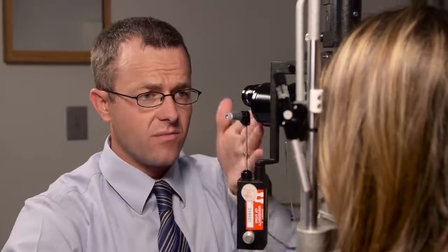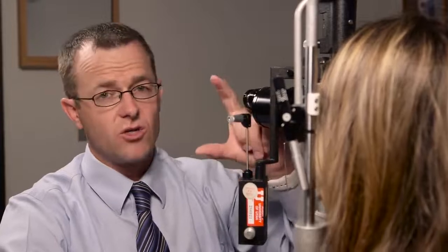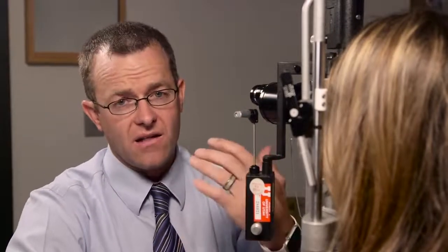First and foremost, I like to do my posterior segment exam using this 78 diopter lens, and I like to do it with my beam not shifted to one side or slanted to one side or the other, but straight on. I feel like that helps me to focus it. Also, what I do is I make my beam a little bit taller and I make it a little bit narrower. And then once I have the nerve and the blood vessels and the macula in focus, then I'll change the size a little bit. I'll shorten the beam down and I'll widen it just a little bit. And that gives me a lit up area that's a little bit easier to see. And then that'll help me to focus in on the nerve and the blood vessels and that sort of thing.